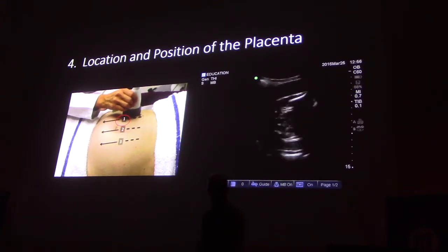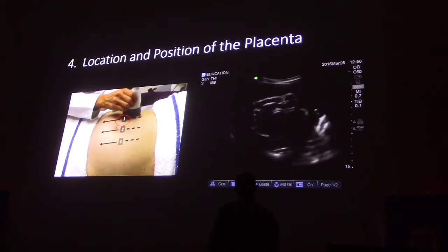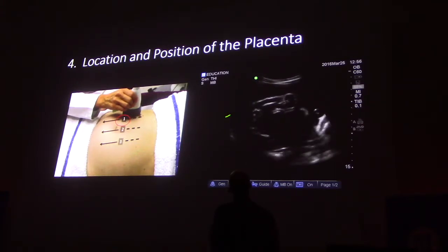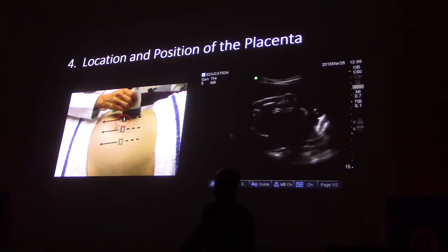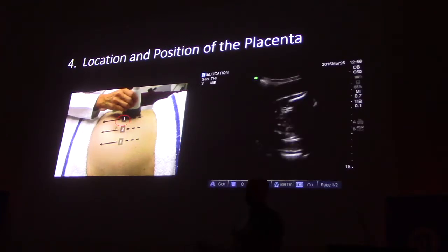So back to sagittal. So this patient, we saw it earlier, has a placenta here, and in general, they're pretty easy to see. They're not necessarily on my images on this screen, but they're generally going to have a homogeneous texture, architecture to them. And they're going to be implanted along myometrium. They're going to be slightly different in echogenicity from the myometrium. They're fairly easy to distinguish. They're also quite large, should be easy to find.